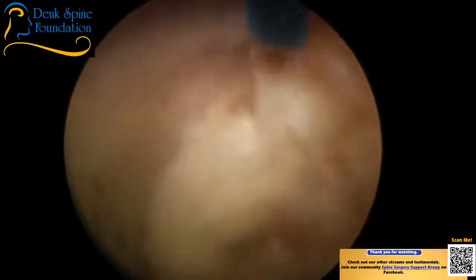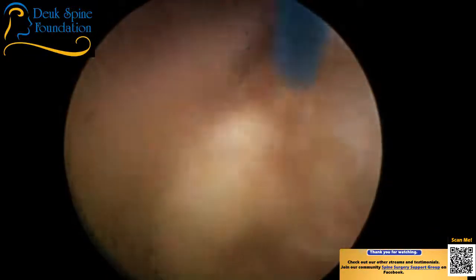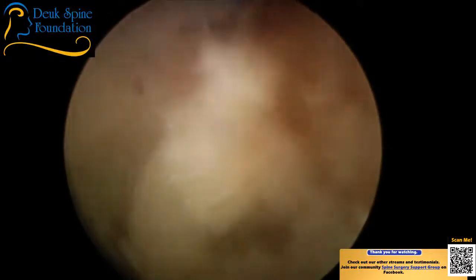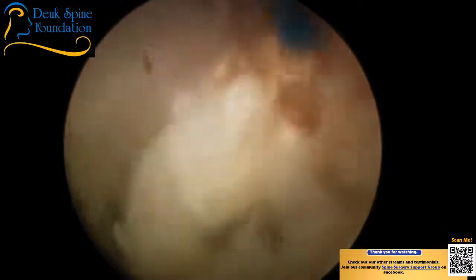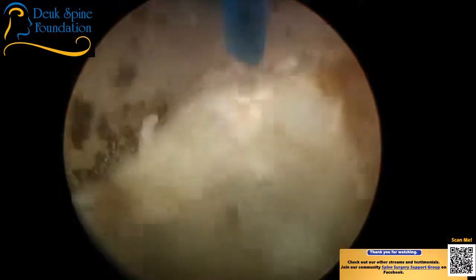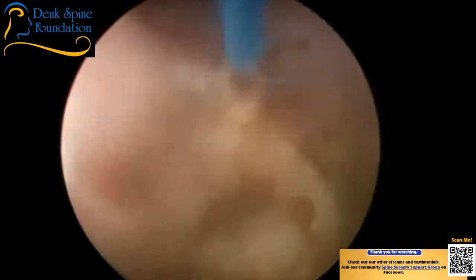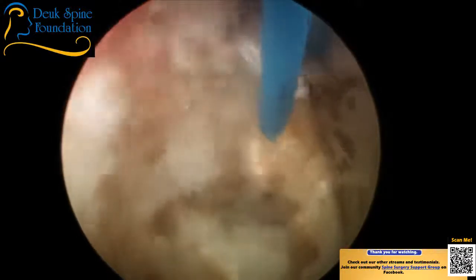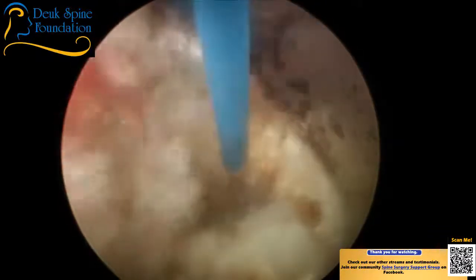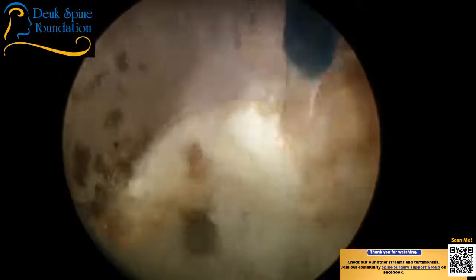Most surgeons don't treat pain, okay? Spine surgeons don't treat pain. They don't believe surgery works. That's because all they have is more primitive types of surgery like fusions, laminectomies, discectomy, and now artificial disc. But those surgeries are very bad at treating pain from a disc. This surgery you're watching, the whole purpose of the surgery is to treat pain from a disc. Because what I'm doing is something that no other surgeon does. I'm cleaning up the annular tear with the laser so it can heal properly and heal painlessly.